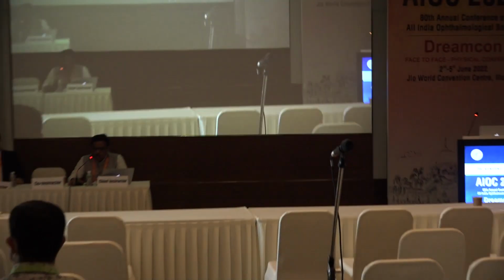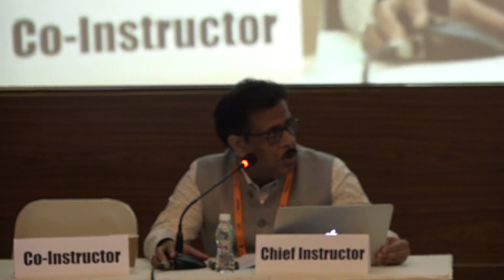Thank you, Dr. Santanu. I have a few questions, like whether this cyst was preoperatively visible or not? Not visible. It was at the periphery, with some abnormal vascularization, but that was not clear due to the cataract changes in the lens. Complicated cataract was there, media also had PVR changes, vitreous haze was there. So it was at the very periphery. Such a large cyst, and what do you think it is? It is a sign of old RD.